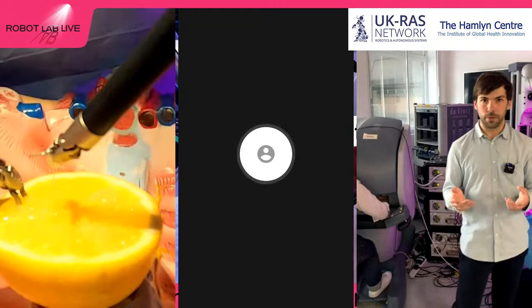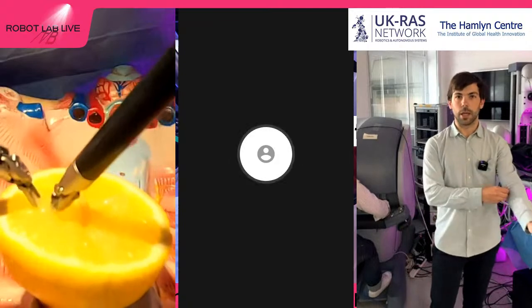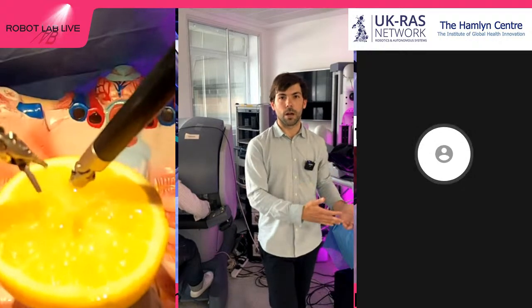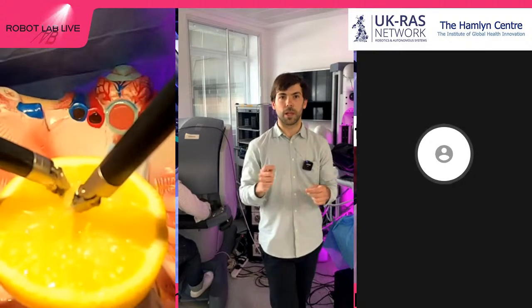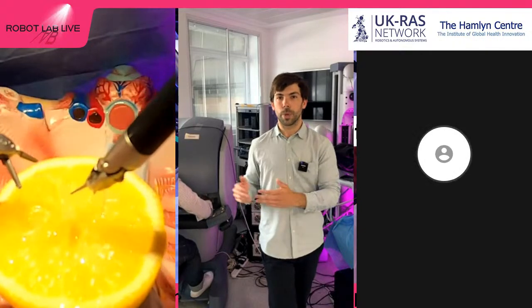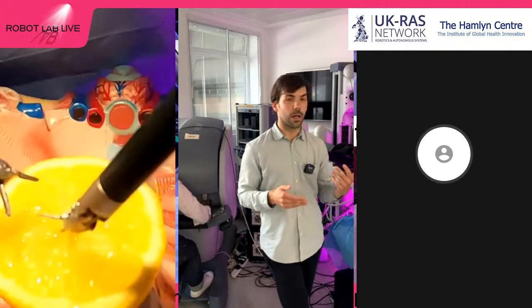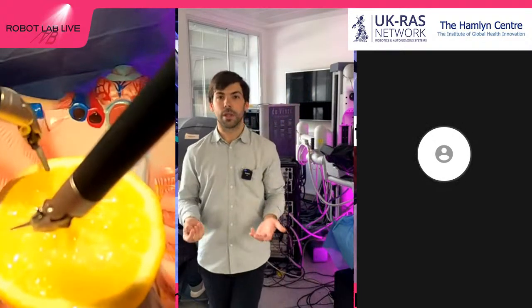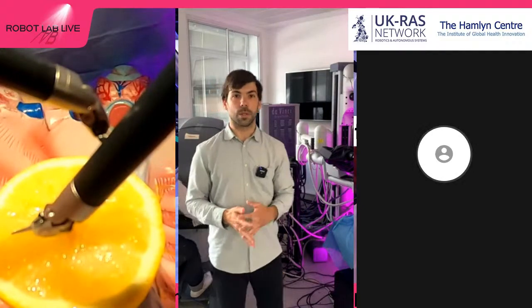For instance, as you can see on the screen, the lemon is static, right? And some of you have already thought about it, right? But if it was a heart, the heart is beating and moving, right? So of course, the surgeon is able to realize this motion and compensate for it. But what about if we have an autonomous system? How do we tell the robot that the heart is moving? Everything in this line is being investigated in our center.